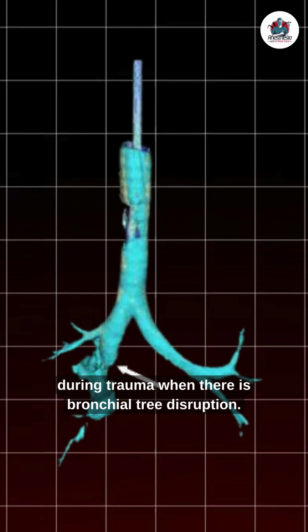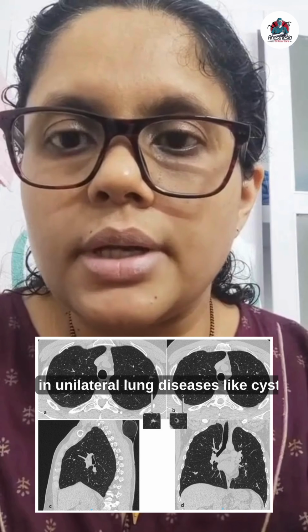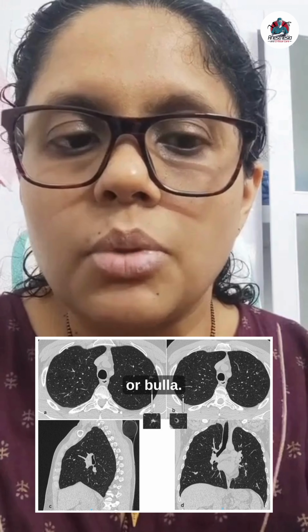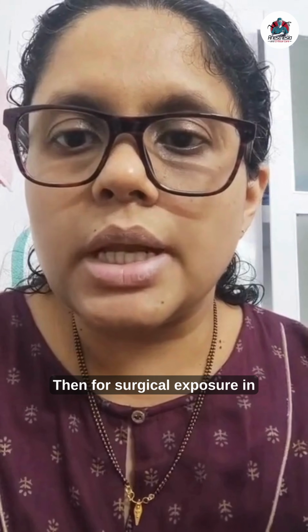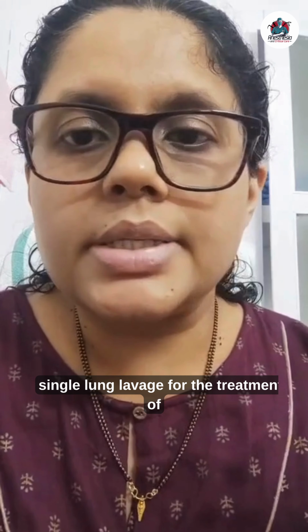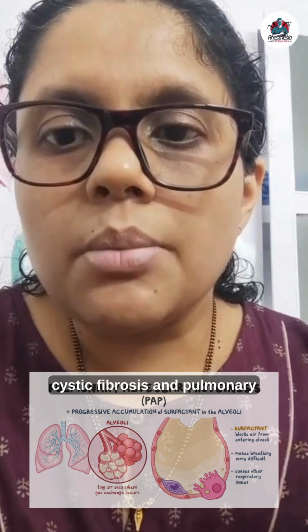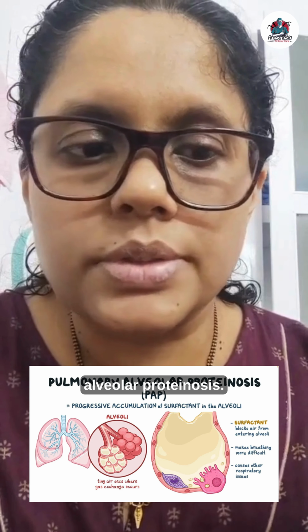Third, during trauma when there is bronchial tree disruption. Fourthly, in unilateral lung diseases like cyst or bulla. Then for surgical exposure in video-assisted thoracoscopy. And single lung lavage for the treatment of cystic fibrosis and pulmonary alveolar proteinosis.